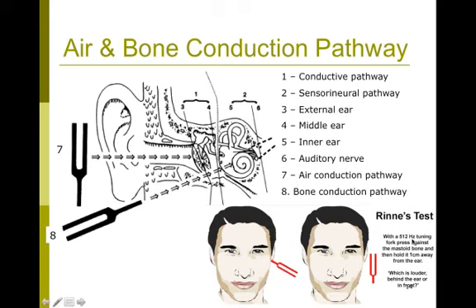And second, often only one tuning fork was used. Like in this instance, it was a 512 hertz tuning fork, which assesses only the hearing at that frequency. And so you would miss out hearing losses that are not flat. If they have a sloping hearing loss, they might actually be able to hear the 500 hertz, but not be able to hear higher frequencies, which are not assessed.